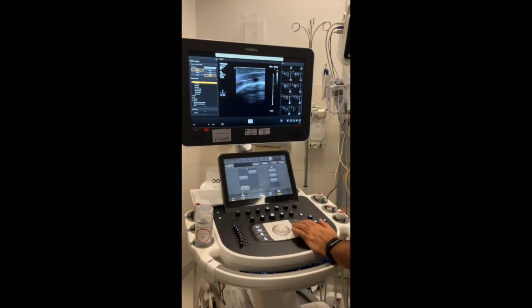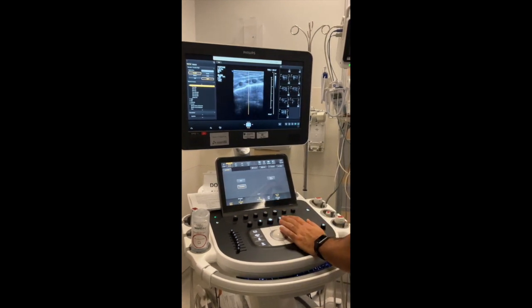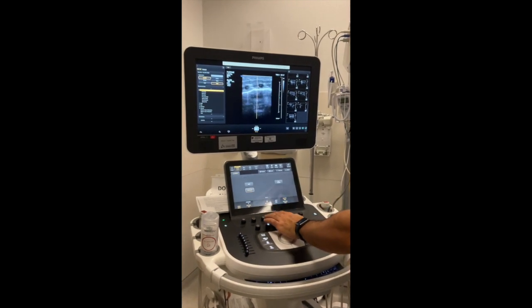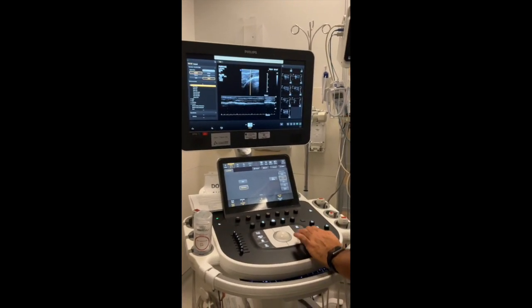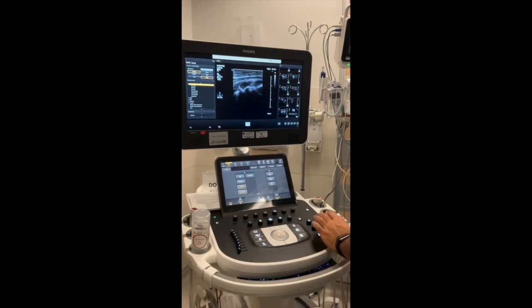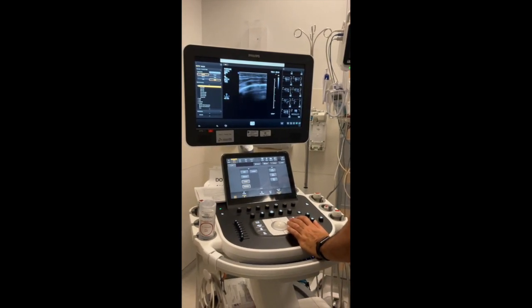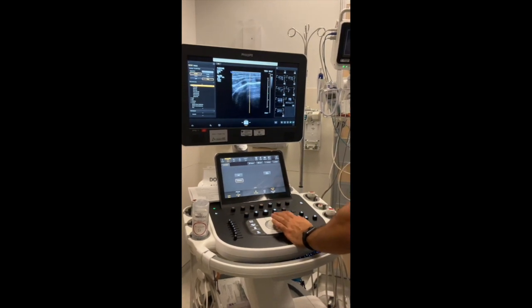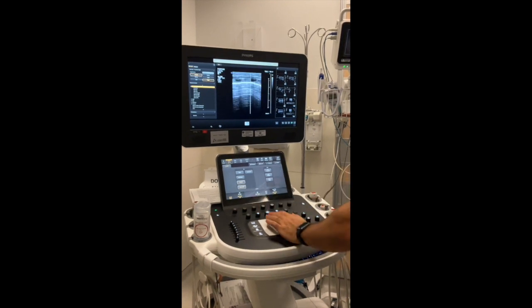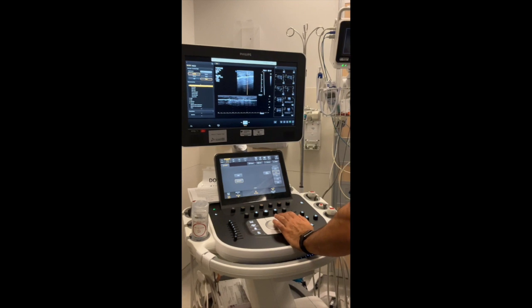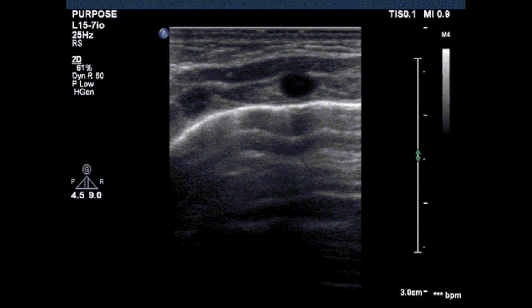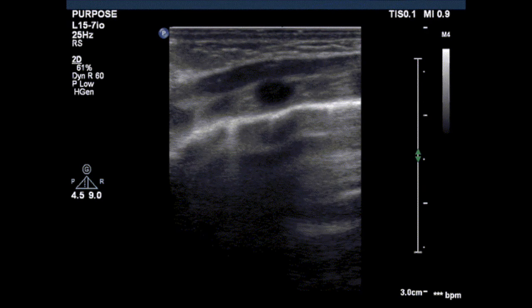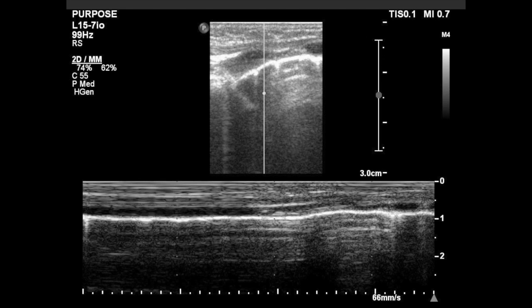As we are here, we can see nicely the A-lines. If we would like to do an M-mode, we could do an M-mode to see the breathing pattern. This is an M-mode where I can see that there are no signs of pneumothorax. When obtaining the M-mode, please make sure to maintain the label of the actual lung zone on the image so that we are able to score these M-modes.